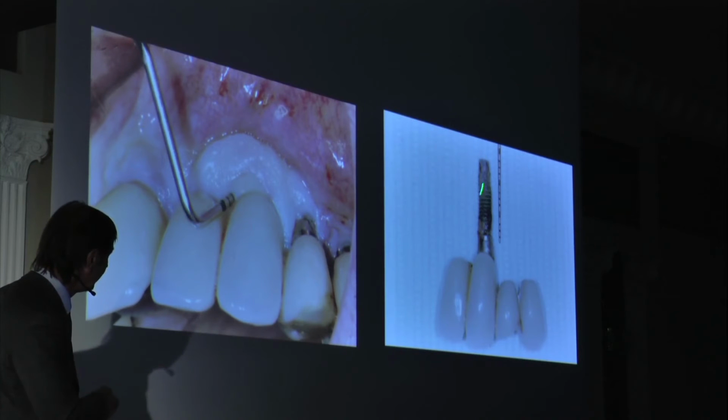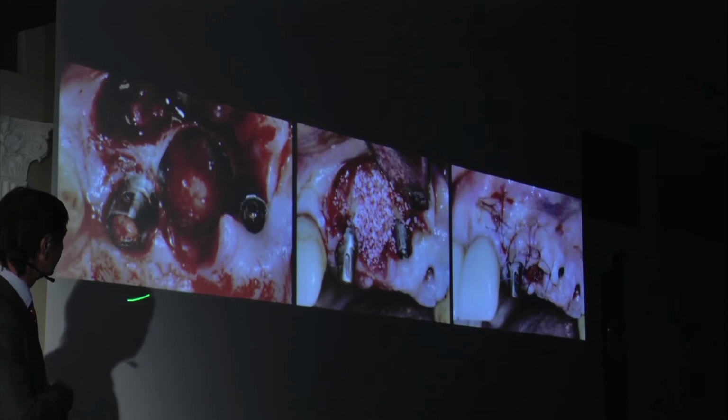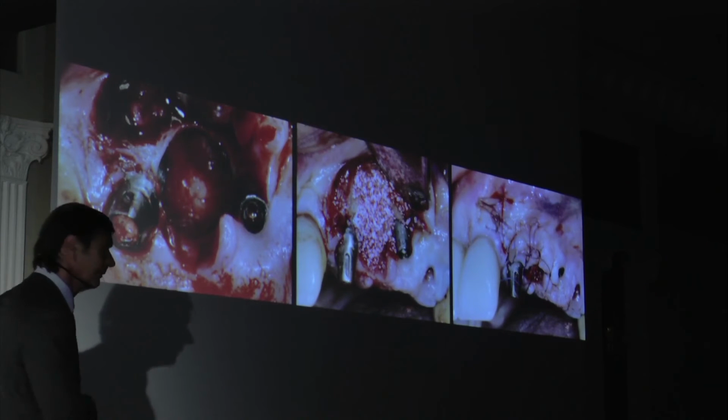When I opened the flap, this is the implant. It was integrated just for 3 millimeters at the apex of the implant. And look at the defect. A huge defect. Then it's difficult to treat the patient again.